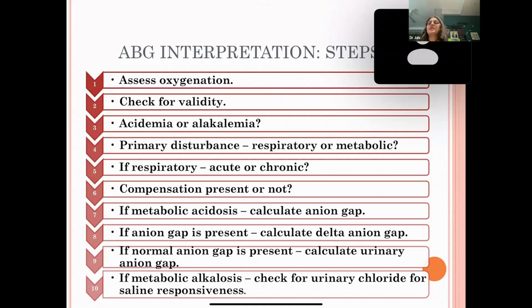Sixth, we need to see for the compensation. मतलब कि जितना जो हमारा प्राइमरी एसिड बेस्ड डिस्टर्बेंस है कॉम्पनसेट हो पा रहा है कि नहीं. ठीक है, मतलब अगर रेस्पिरेटरी एसिडोसिस है तो क्या मेटाबॉलिक एल्कलोसिस भी है साथ में, या फिर कॉम्पनसेट हो रहा है, या थर्ड कोई डिसऑर्डर है क्या. ठीक है, तो ये I will just tell you in the subsequent slides.